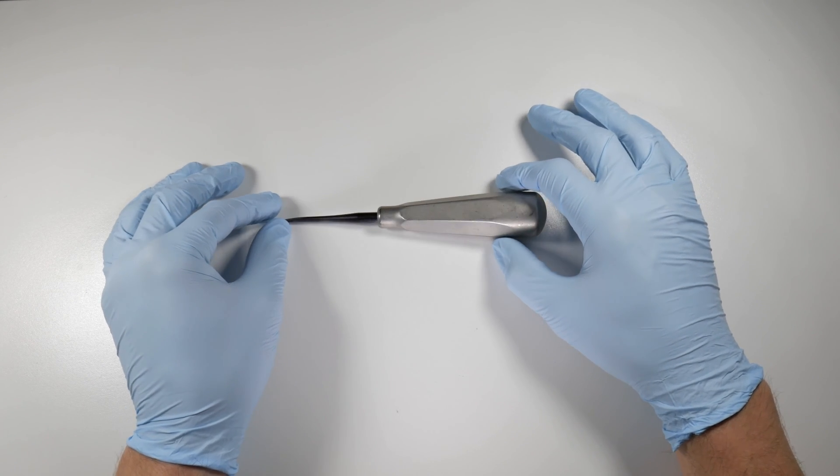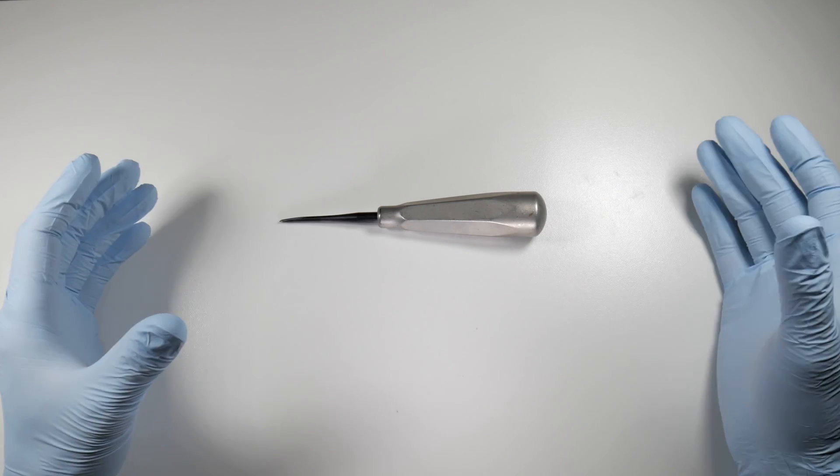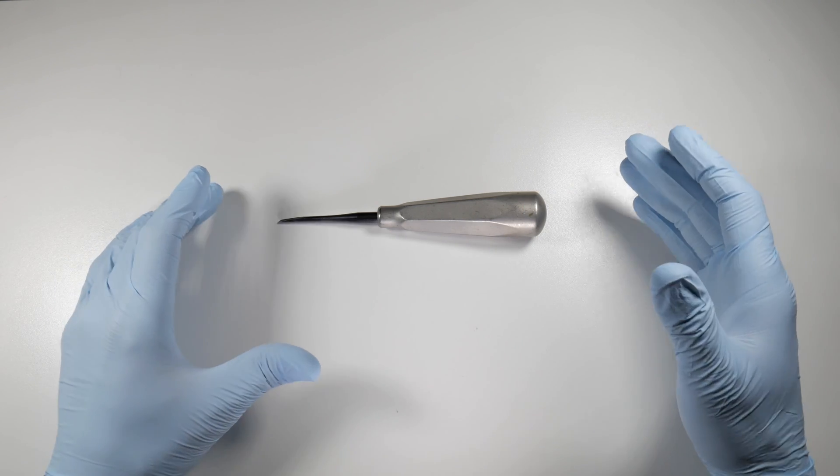It's an excellent pairing with the 700 or 701 burr and a very useful tool for just about any situation. If you haven't tried a luxating elevator, consider getting one and trying it. If you don't like it, that's fine — but I'm pretty sure you're going to get used to it and prefer these over your standard elevators.